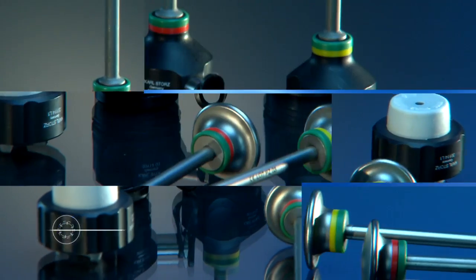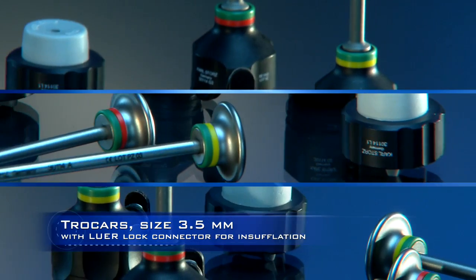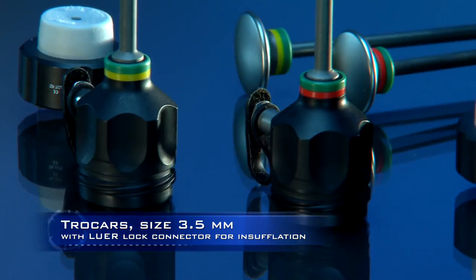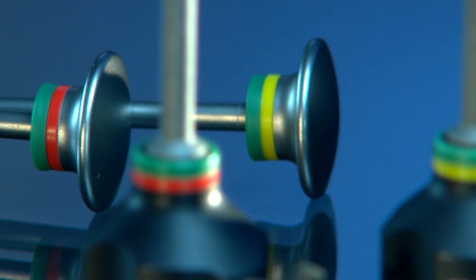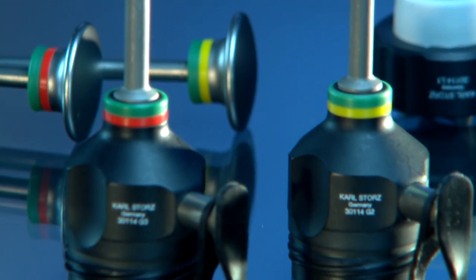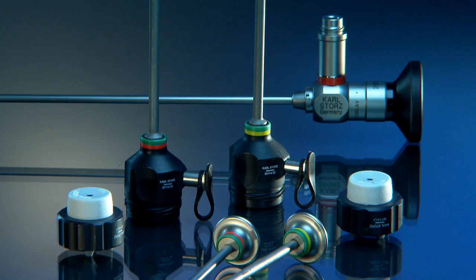The light yet extremely reliable 3.5mm trocars with silicone lip valve leave a barely visible scar and are perfectly suited to the requirements of surgery on adults thanks to their length of up to 15cm.